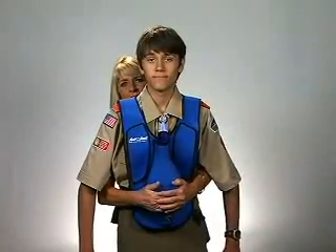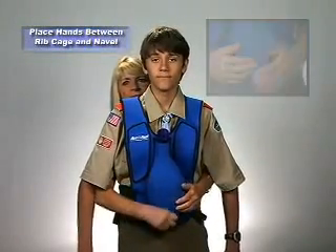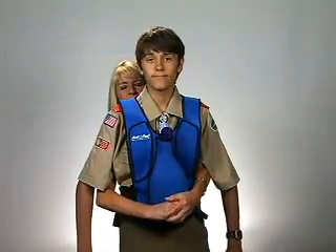If the hands are not placed correctly, the vest will not work. The hands must be placed between the ribcage and the navel. Then, a quick upward thrust must be given.